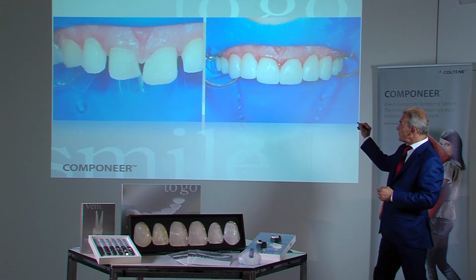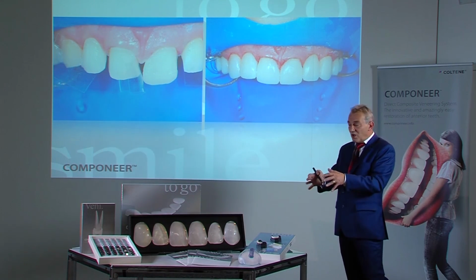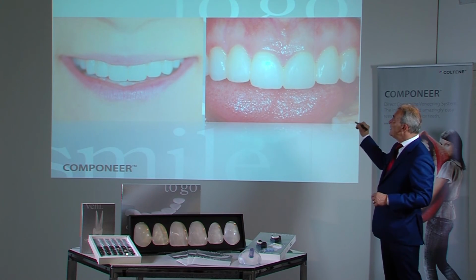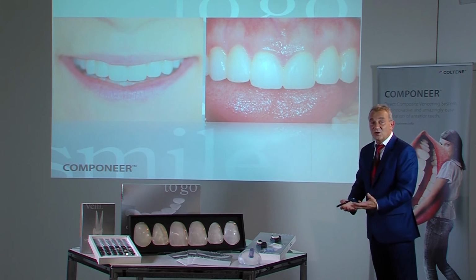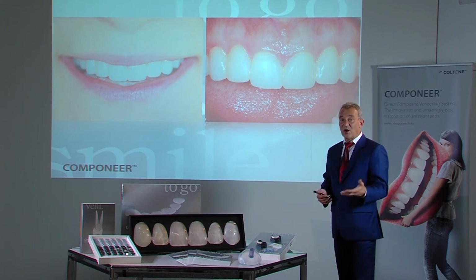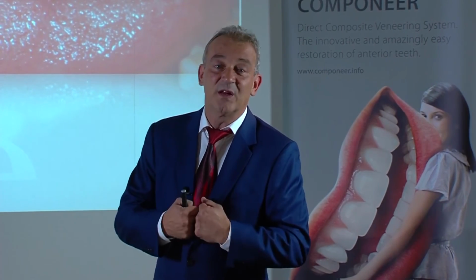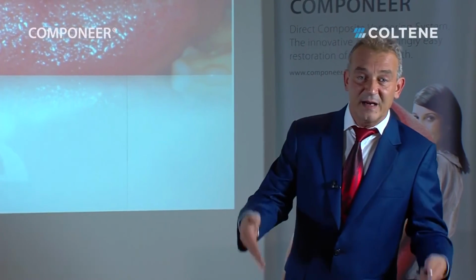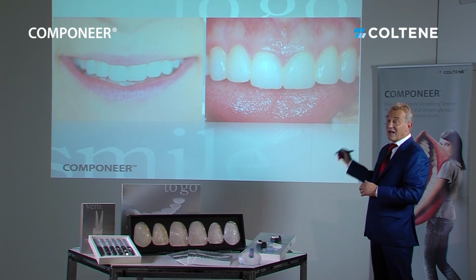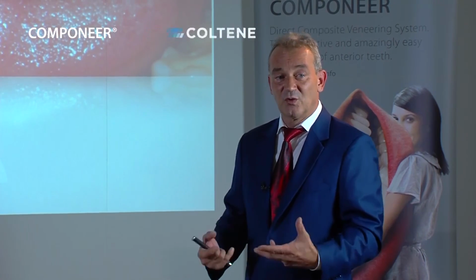This photo was taken approximately 1 hour later. The papilla slowly adapts to this contour and begins to transform itself. 14 days later, the gingiva has more or less adapted completely to the tooth structure. Here it is important to again rework and finish cervically. Even if bleeding commences, it makes sense to rework this marginal area with an oscillating file or similar instrument to avoid any excess. Over-contour is good. Excess is counterproductive.